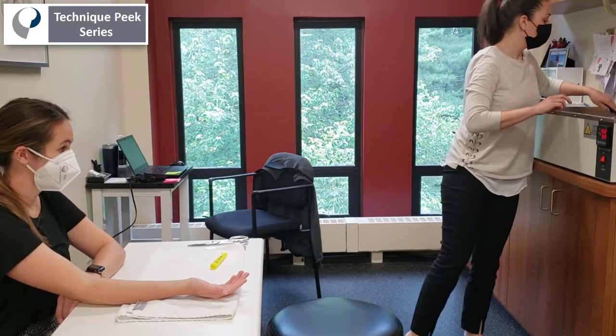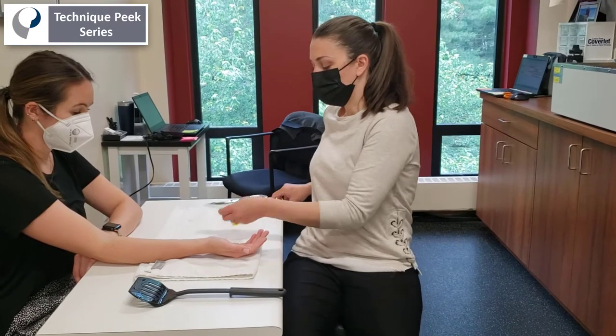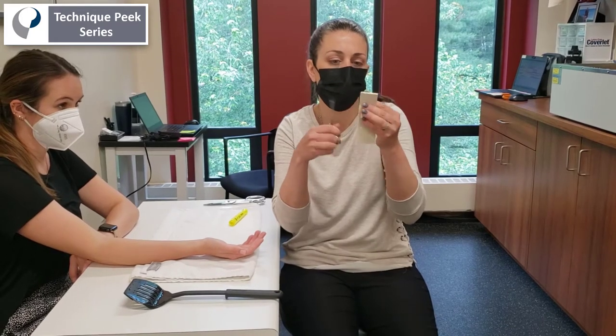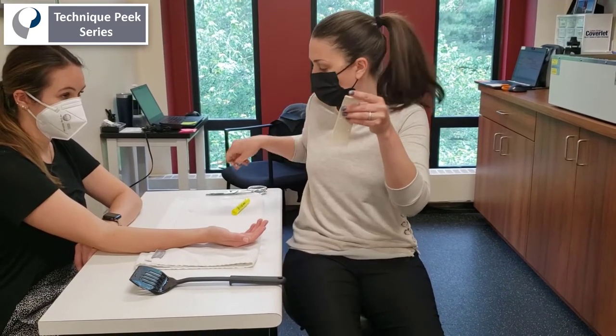Once the material is warmed, you're going to use this opportunity to cut the slits on either side of your material. I apologize it's not zoomed in more in the beginning of this splint fabrication, but towards the end you'll get a close-up view. Here I'm cutting the little strips for the straps on either side of the splint material.